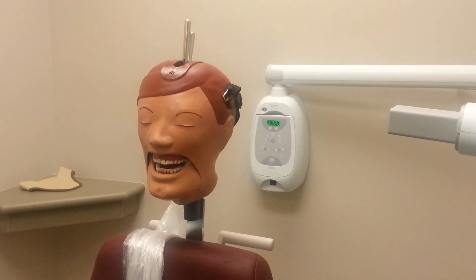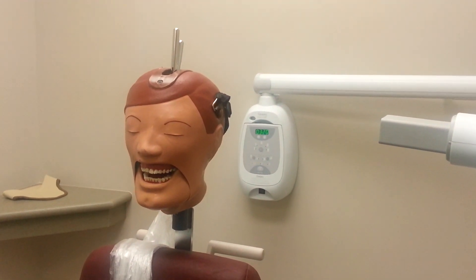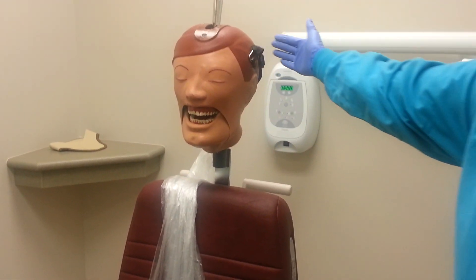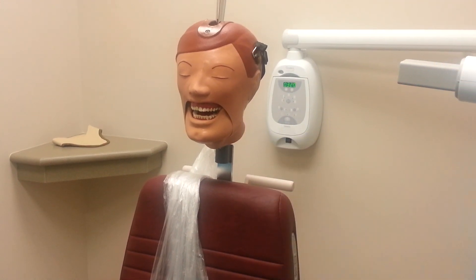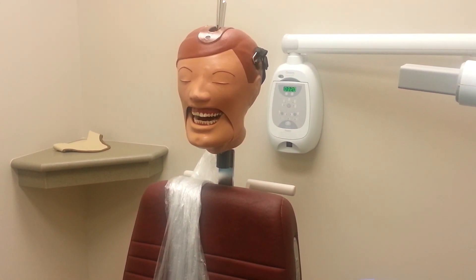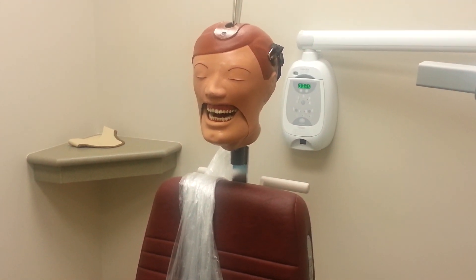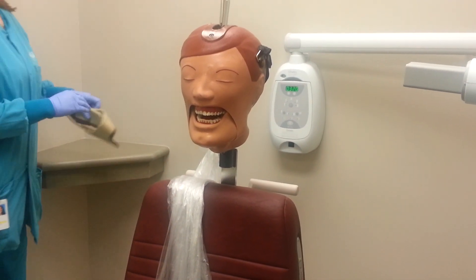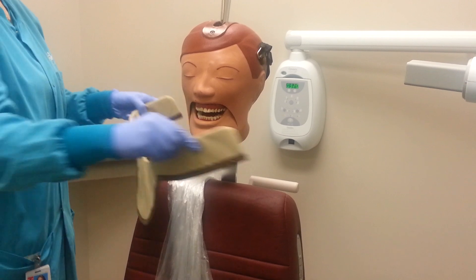You are now ready to take your radiographs. Position the patient so that they are sitting tall with their head properly supported by the headrest. The chair should be at a height that is optimal for the operator. Be sure to place the thyroid collar around the patient's neck, or a full apron if the patient is a child, pregnant, or if the patient requests it.